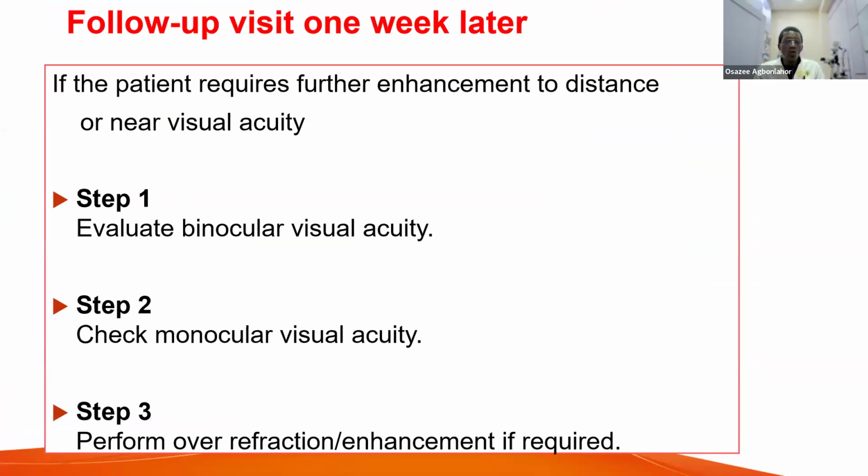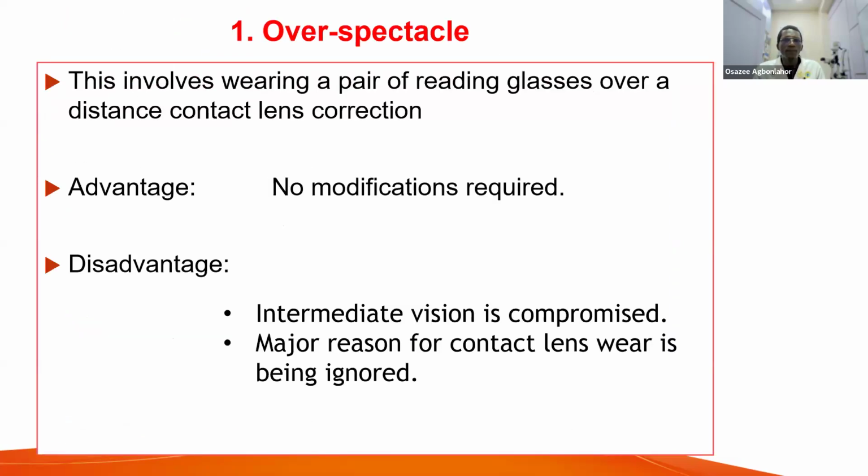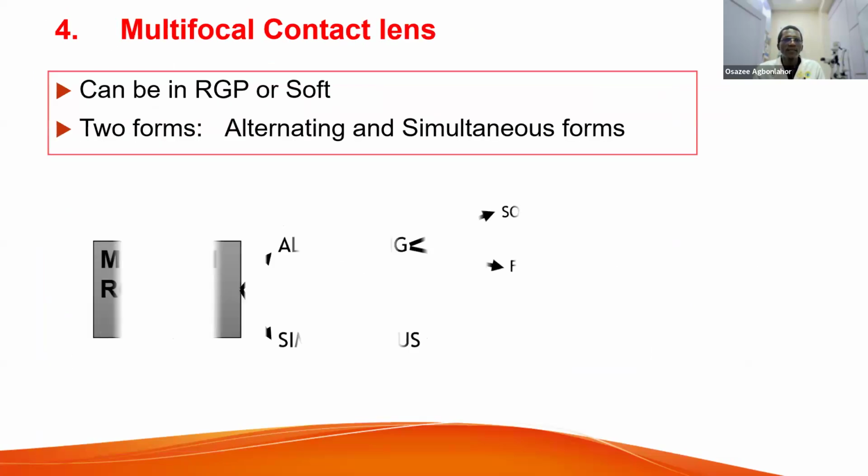Then after that, if there's no issue, there's no concern, you usually ask the patient to return after a week for follow-up. You assess all of these things again to be sure that this patient is comfortable. Contact lenses, especially for multifocal contact lenses, we don't just dismiss the patient immediately. In fact, if the patient comes, they have to wait, for say maybe 1 hour or more, for you to be sure that whatever you're doing is correct. We have mentioned all of this before. So let me just move over this.